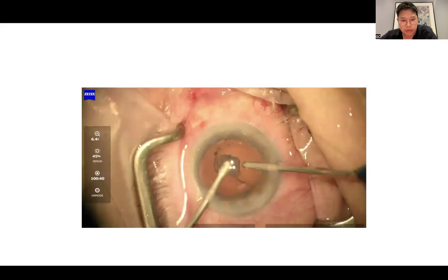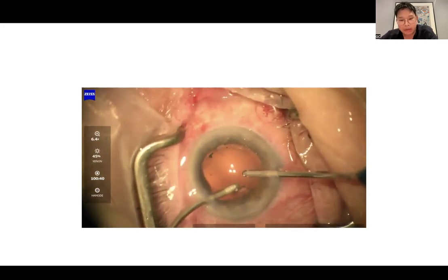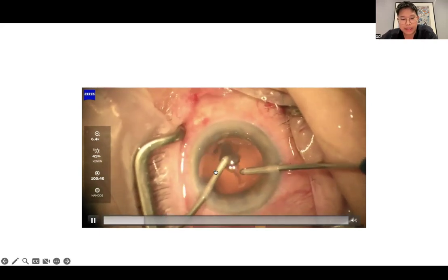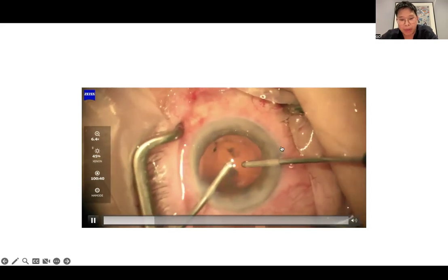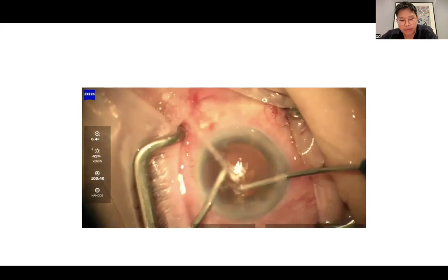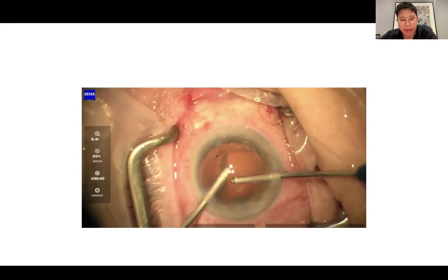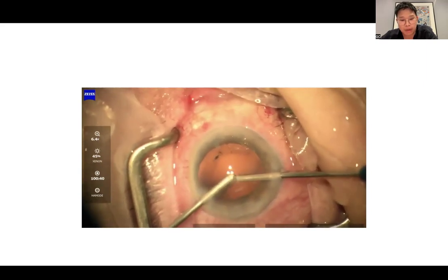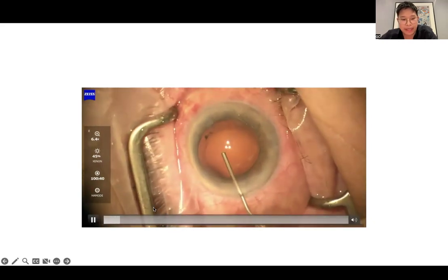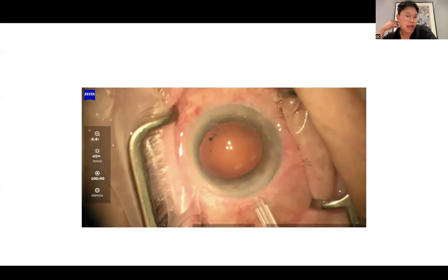This is a post-angle closure cataract. After we successfully get the lens out, we know that the capsular bag should not be flopping around like this, as Yura mentioned. So really, these are eyes at high risk of complications. And so here you're watching the bag flop around, and where there's less than 5 clock hours of zonular instability, really just filling up the eye and putting in a standard capsular tension ring can suffice.